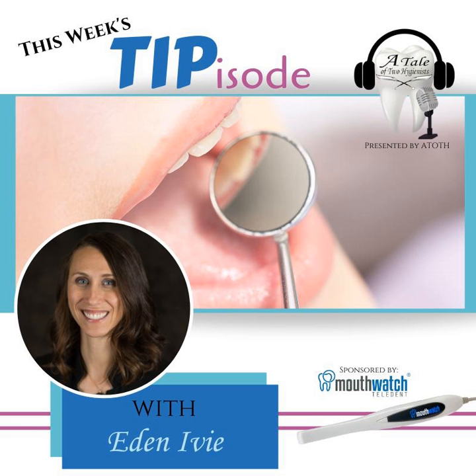Intraoral cameras are also going to make documentation so much simpler for you. Now, when you're documenting in a chart or if you're tracking a soft tissue lesion or you have a watch on a tooth, you can write down a description, but that description is always going to be a little bit subjective. You might put size, color, location, duration, margins, but when you go back 2 weeks later, are you really going to be able to tell from that description if anything has changed on that tooth or on that lesion?